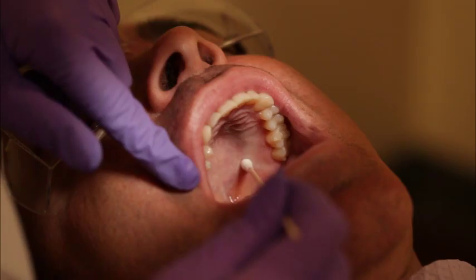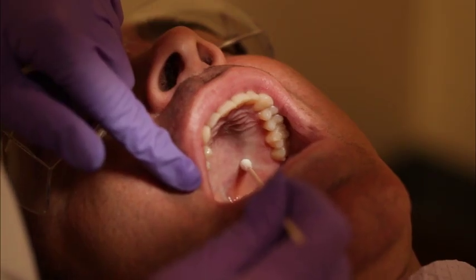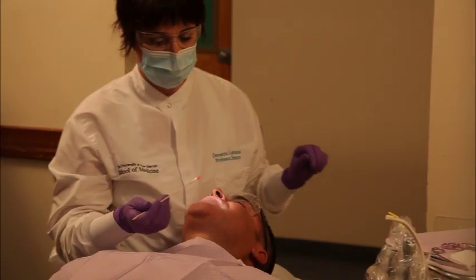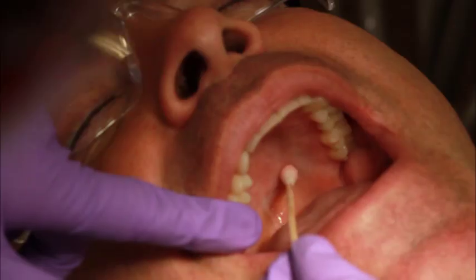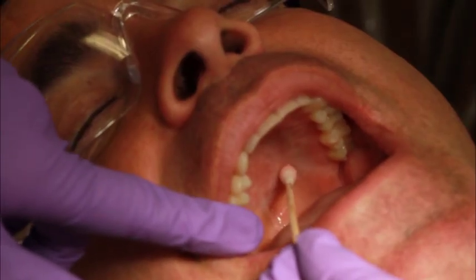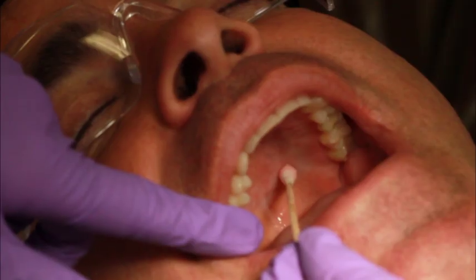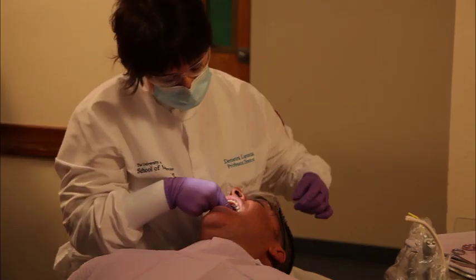Usually, the foramen is located near the maxillary third molar, although it can be located anterior or distal to this area. Be careful not to cross the more yellow-tinged soft palate with the applicator, which will induce gagging. Prepare the tissue with topical anesthetic slightly anterior to the greater palatine foramen. Dry the tissue to remove any excess topical anesthetic.